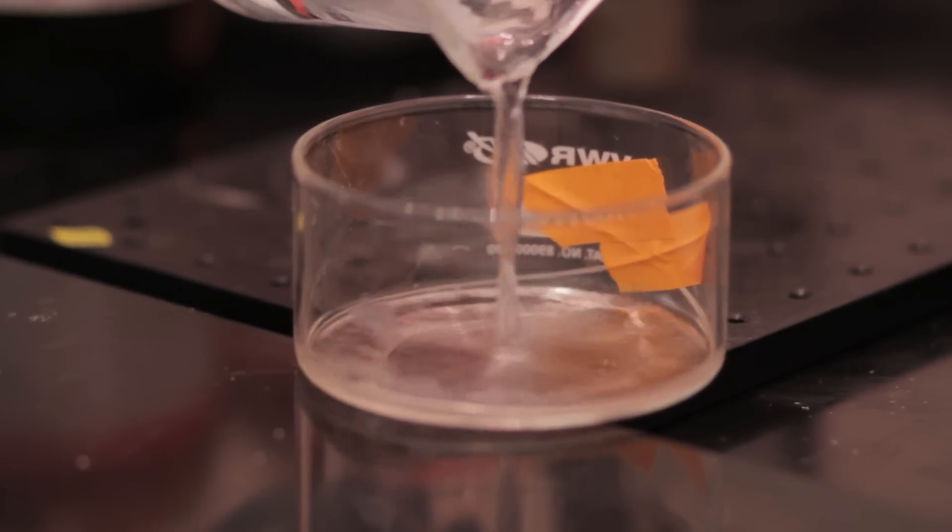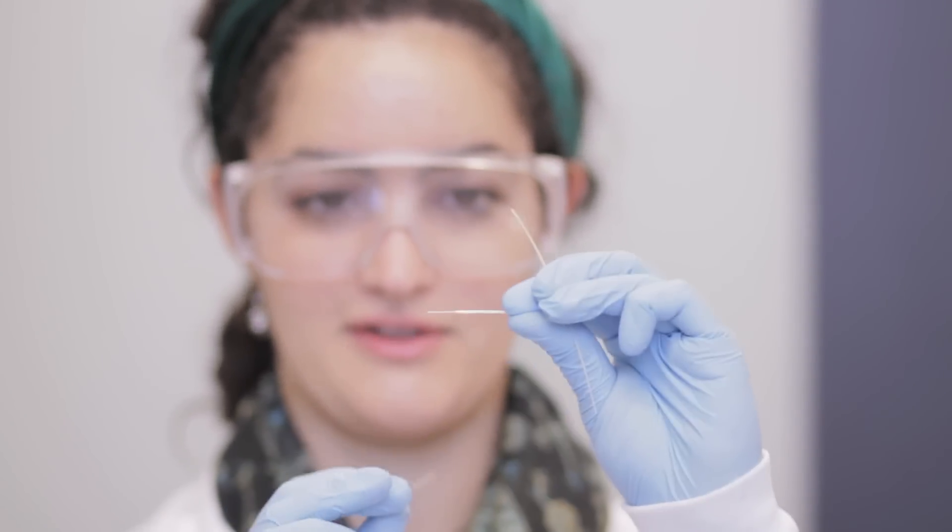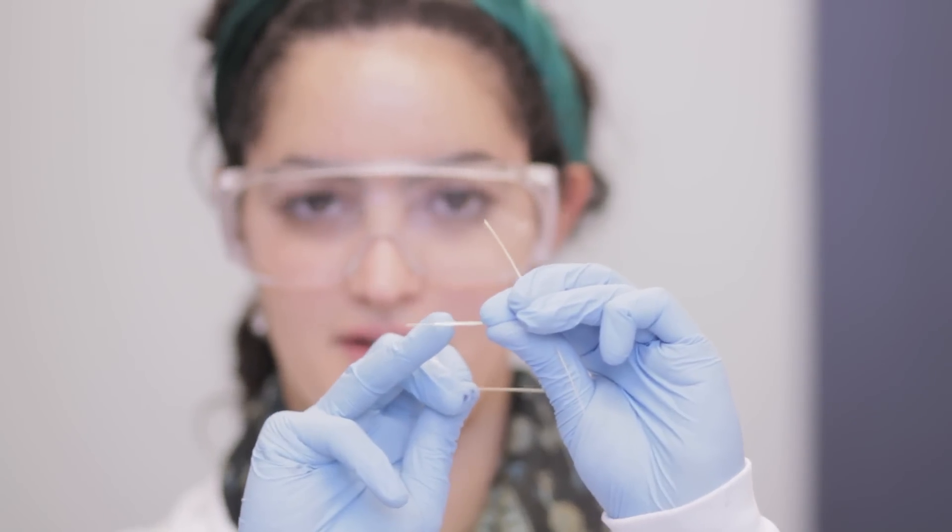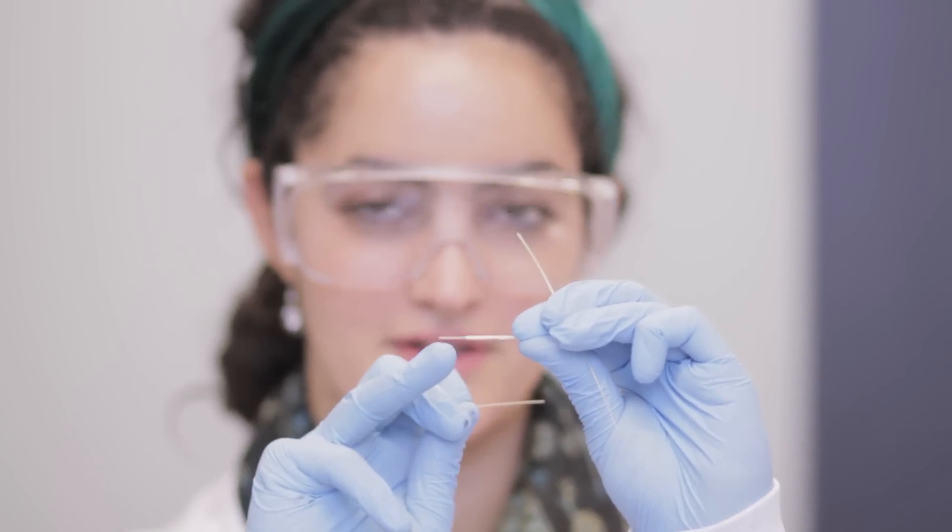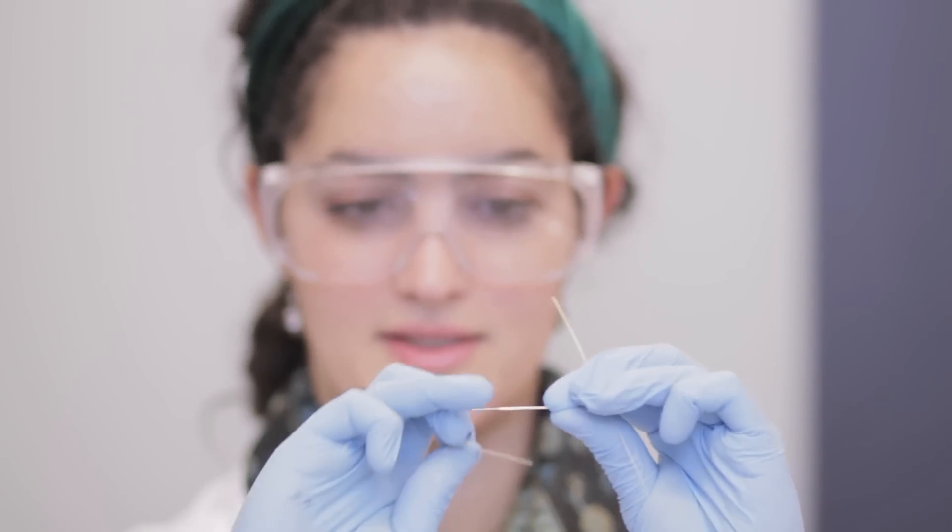We started off with a diameter similar to this one, which is about the diameter of a fishing wire. This piece here shows the transition from that thicker fishing wire to a diameter closer to human hair. It's this thinner piece here that we're going to start using to connect to a board and prepare for implantation.